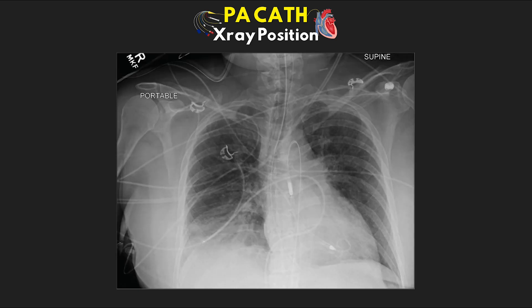For example six, there's quite a bit going on, so it's not going to be necessarily the easiest to see. This example is actually twofold — first, it's inserted femorally, as we can see the approach coming up from the inferior vena cava. If we continue to follow the catheter, we see it ends up deep in the right lower lobe pulmonary artery. This is not a good position, as we are at risk for being in a continuous wedge, for over-wedging, as well as the risk of infarction of the lung, or if the wedge balloon is inflated, we could damage or rupture those smaller vessels, which could be life-threatening.